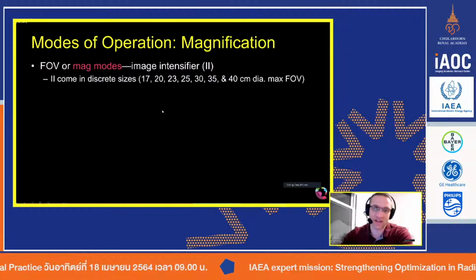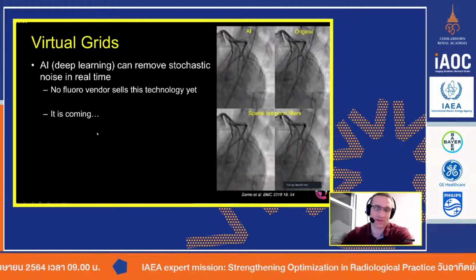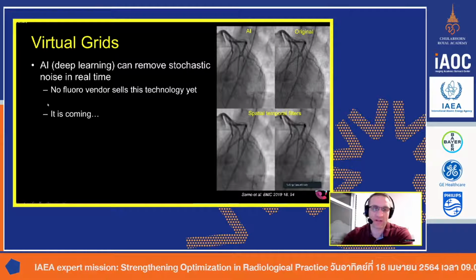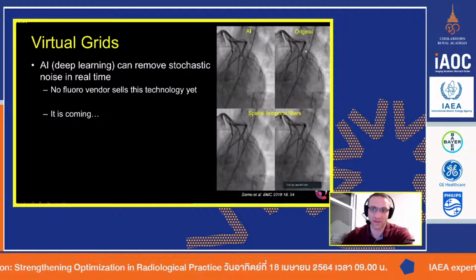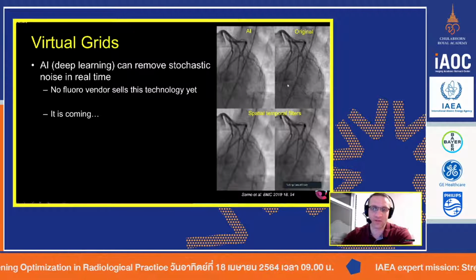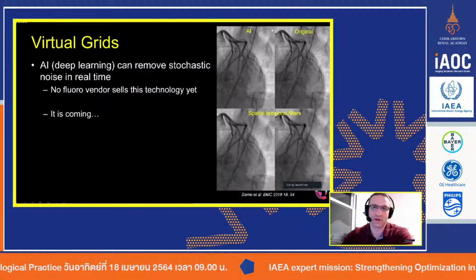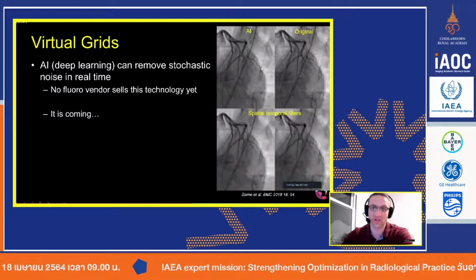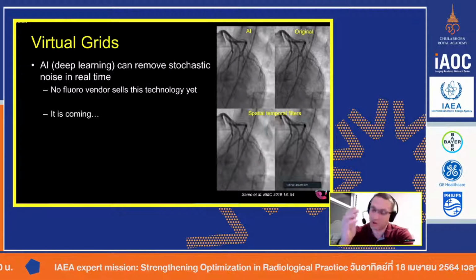And I should say, in fluoroscopy, this is not even an option to purchase at this moment. But having talked to various different vendors and actually seen various different vendors' implementation, it should be coming out soon, and this whole AI thing for fluoroscopy is going to be really amazing. It's going to really reduce the image noise. How impactful it will be clinically is yet to be determined, but it's coming.